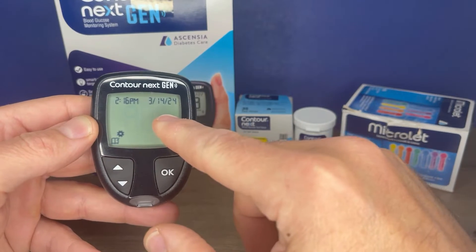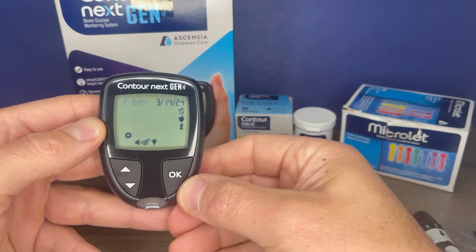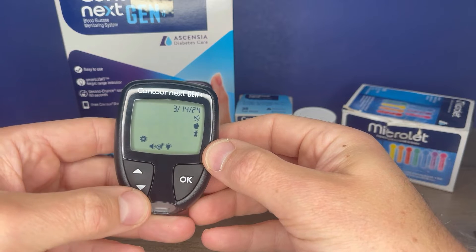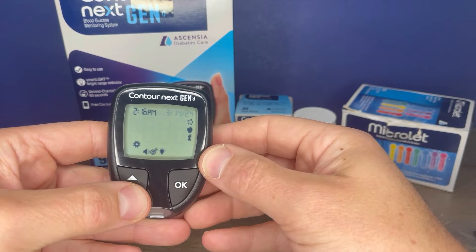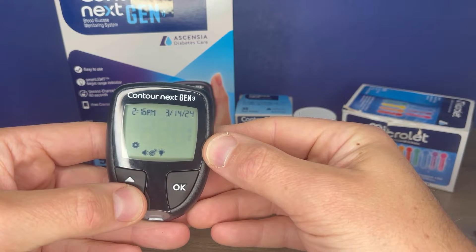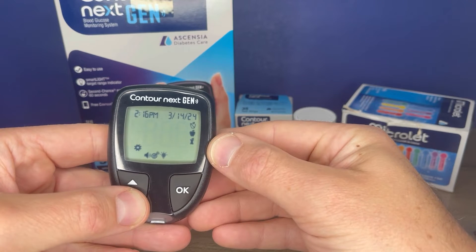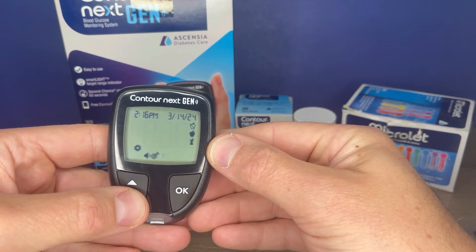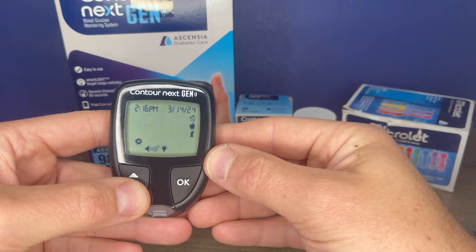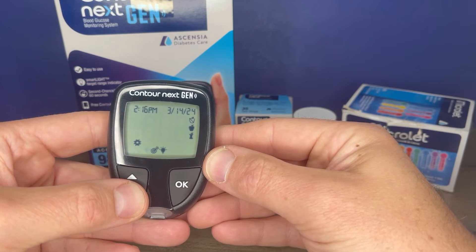If your date and time are not correct, you can go into your settings menu to change that. When the settings icon is flashing, press OK. It's flashing on the time, and if you want to set the time you can press OK and it will take you to the time. Then there's your date — when that's flashing you can adjust that as well. The mealtime indicators is an option which we will cover later in the video. That's if you want the lights to come on on the test report indicating if your blood glucose is in range, for setting your target range of blood glucose. And that is for the system sound.